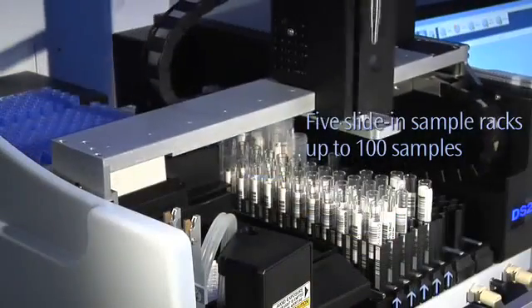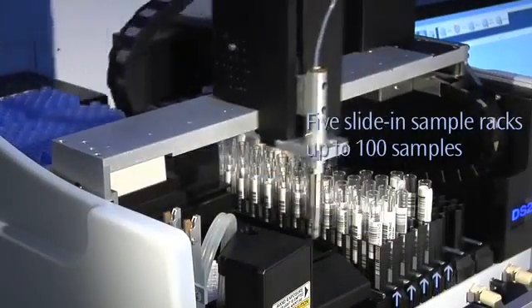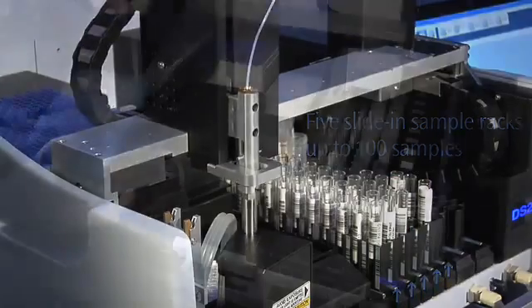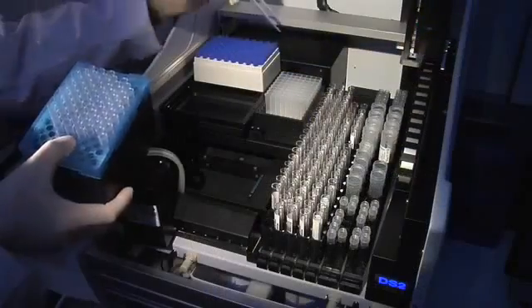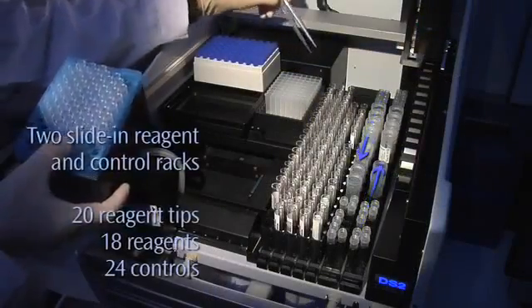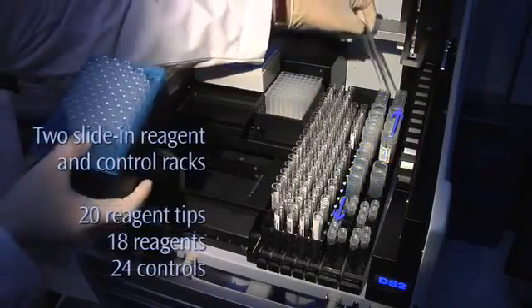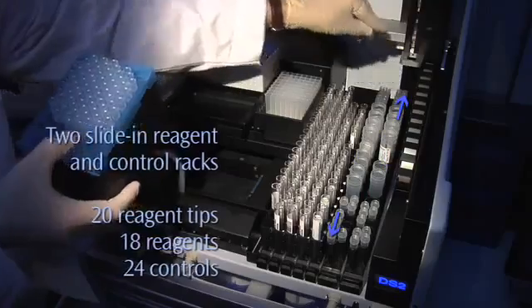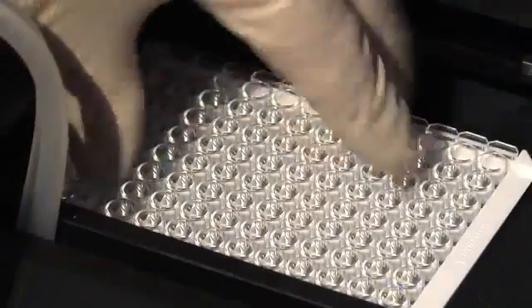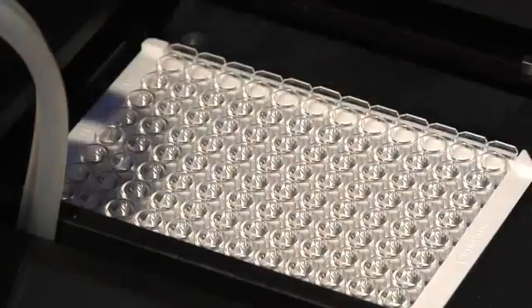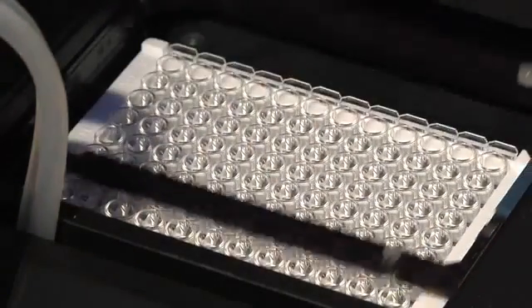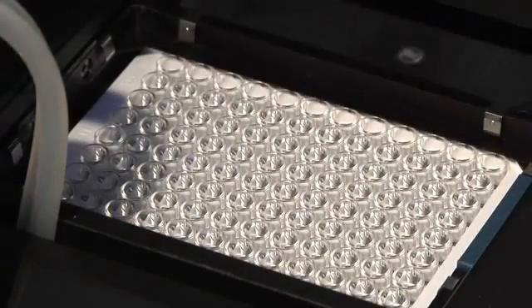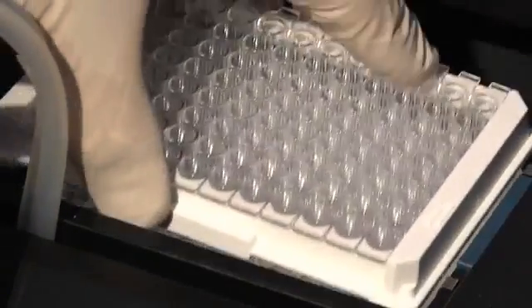Five slide-in sample racks hold up to 100 samples. The DS2 has two slide-in reagent and control racks for easy consumable access. An innovative multi-plate carrier holds two 96-well microplates.